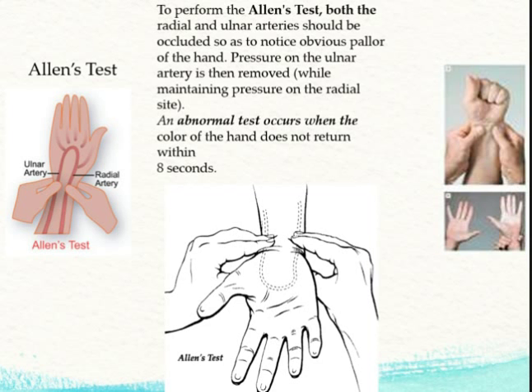As you can see, their blood flow should come back fairly quickly, under 8 seconds.